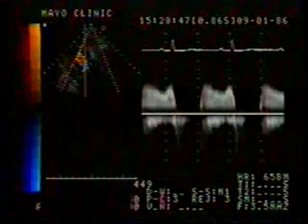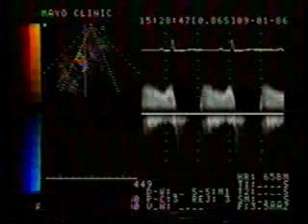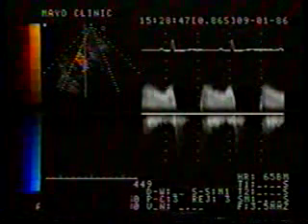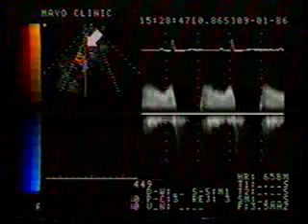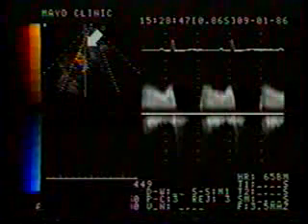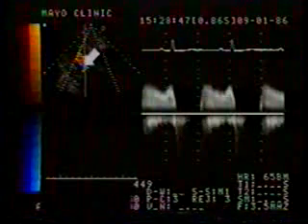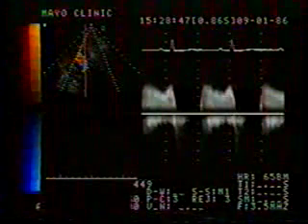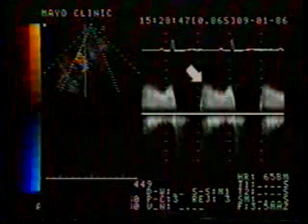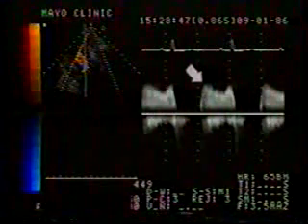Color flow imaging can help guide the CW Doppler exam. This assumes greater importance in patients with eccentric jets. A continuous wave cursor is now being utilized to interrogate the mitral valve. The jet allows us to see that the CW cursor has been misaligned, creating this angle, theta. Because theta is large, we know that this E velocity, 1.7 meters per second, underestimates the true E velocity.